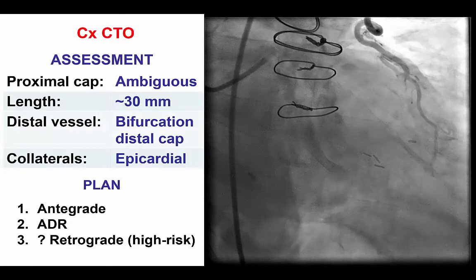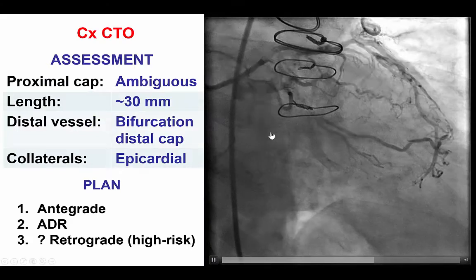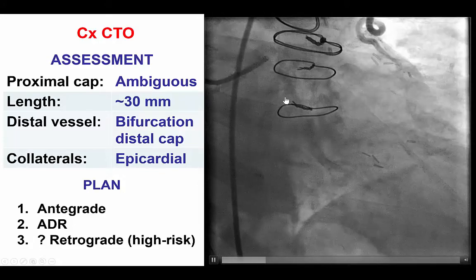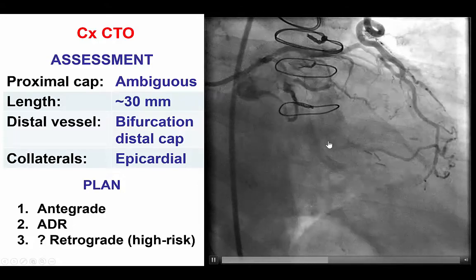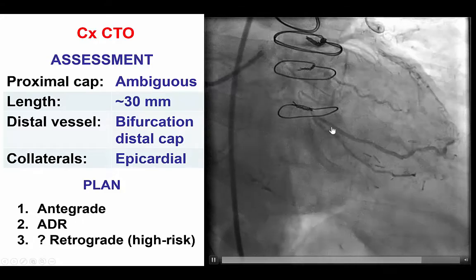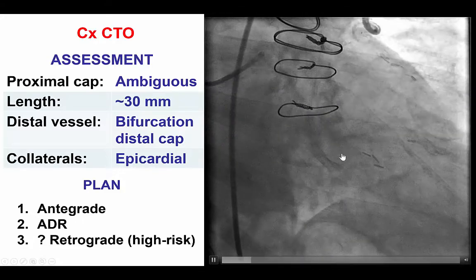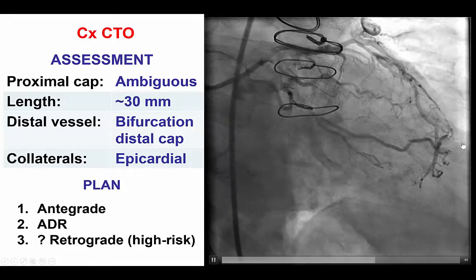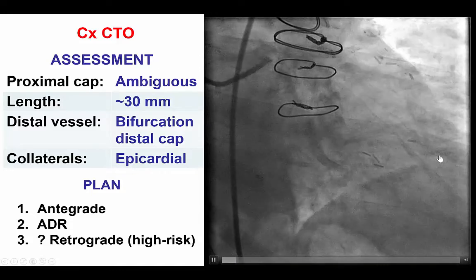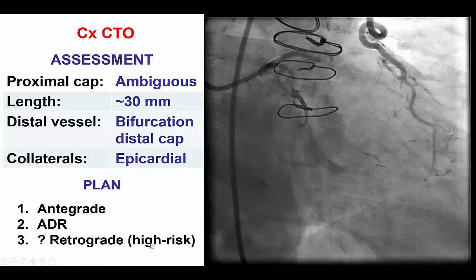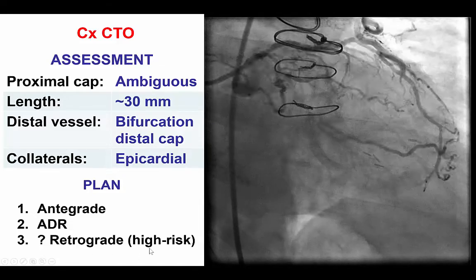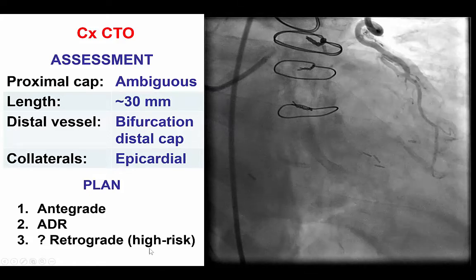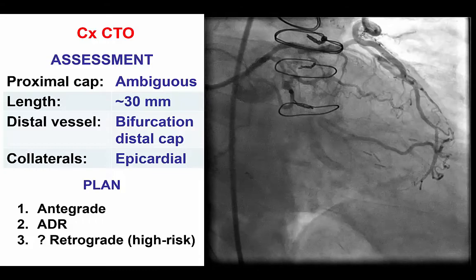This is the dual injection. Once again, we have an ambiguous proximal CAP. The occlusion is not too long, about 30 mm. There is a good quality distal vessel; however, there is a bifurcation close to the distal cap. The collaterals are epicardial from the LAD, which in turn fills the LIMA, and therefore may not be the best for going retrograde given that we would have to go through the LIMA, down the LAD, and through this very tortuous epicardial collateral. So this is mainly an antegrade case.